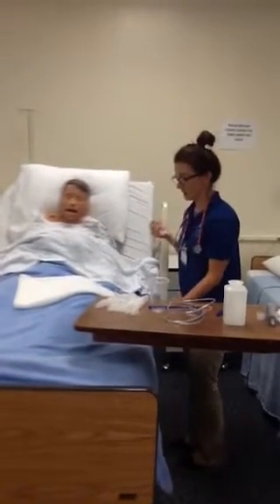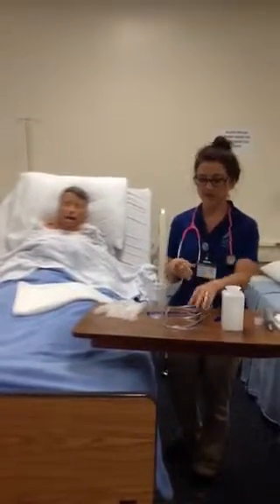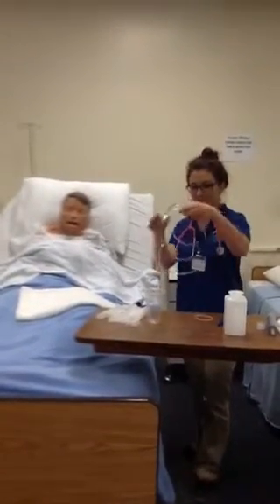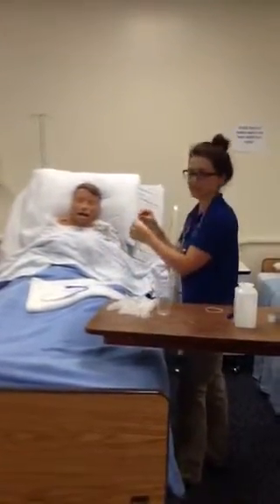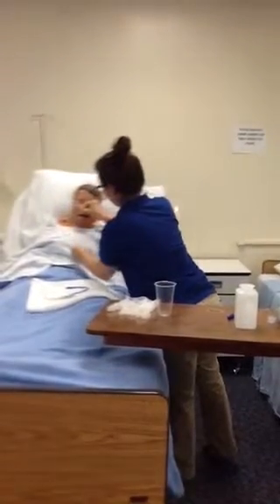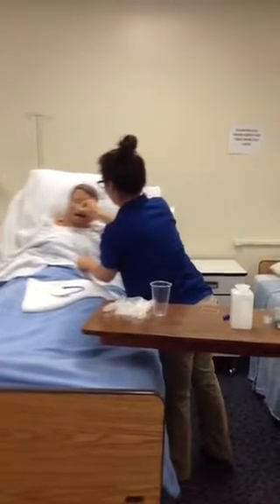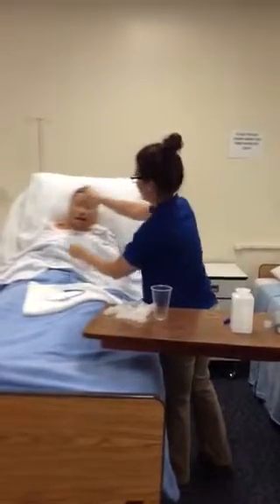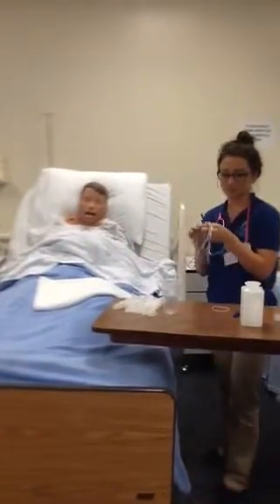Okay, so now I am going to measure the length of the NG tube, which is going to be using the NEX method. From the tip of the nose, around the ear, to the xiphoid process, the left upper quadrant. Okay, so I have measured the NG tube.